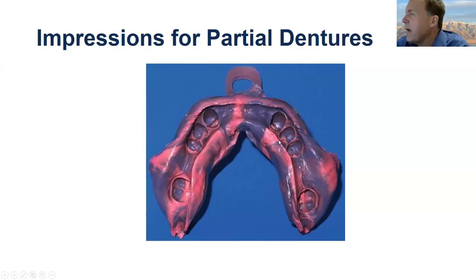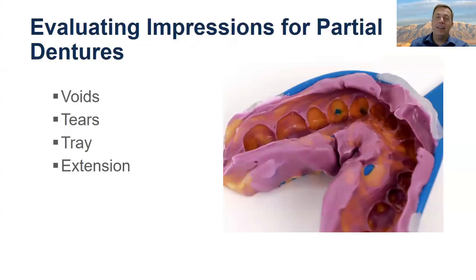One other little trick I would say is, let's say you had a large gap here and you're not planning on putting clasping in there. Sometimes a little bit of ortho wax can help so that the impression material doesn't get locked in there and rip or whatever. But yeah, this is beautiful. So do this. You guys are like, for that easy, everybody be doing it.